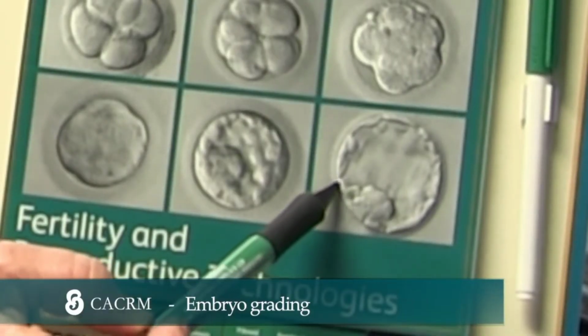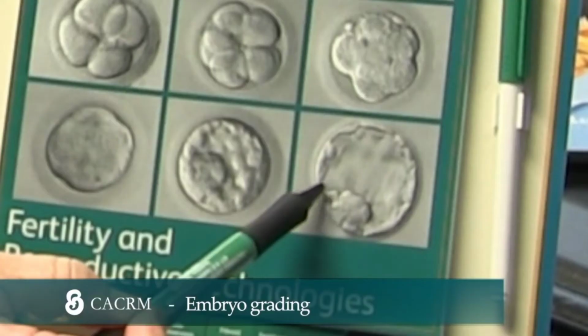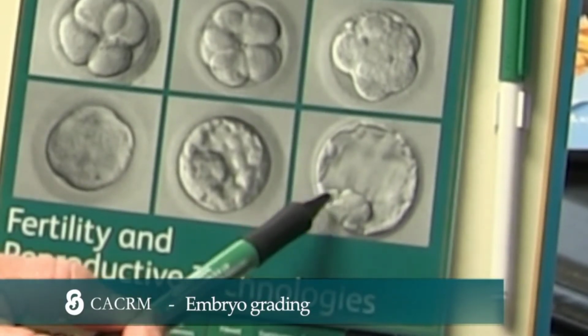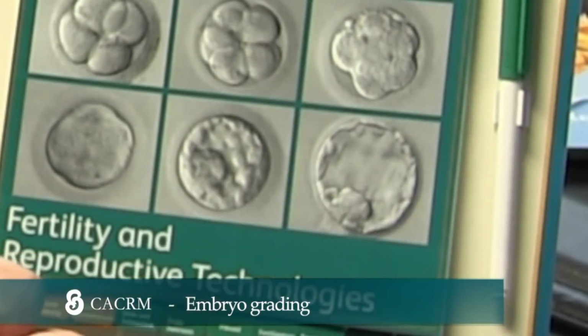The grading scale is on a scale of A, B, or C, A being fully expanded and fully enriched with cells of the trophectoderm. B is still good, and C is a smaller inner cell mass and fewer cells on the periphery of the blastocyst.